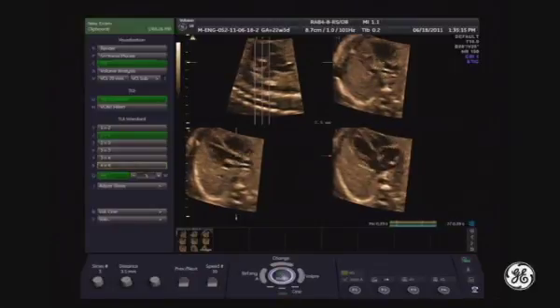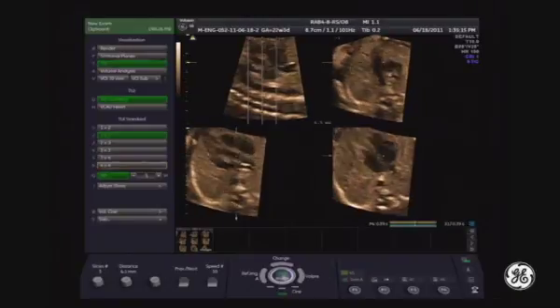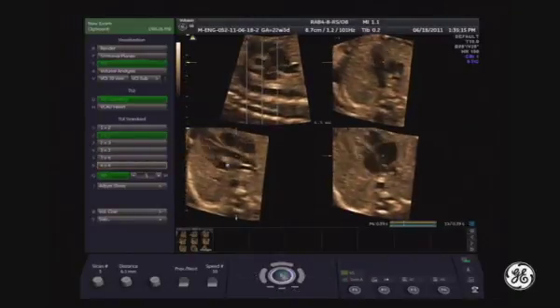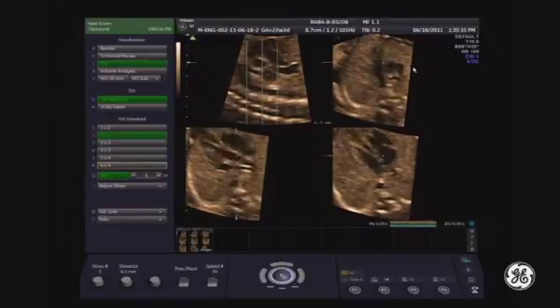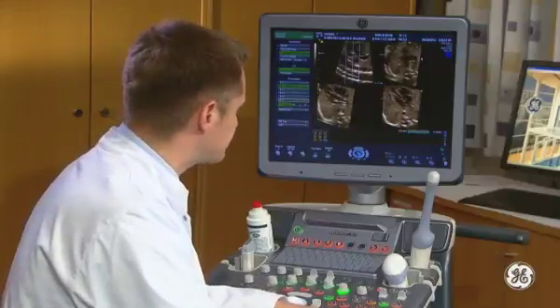And then I will increase the distance between the slices. Now you can see in one screen 3 major views. The aortic root is displayed here. Here you have the 4-chamber, and this is the right outflow with a classical 3-vessel view. So this is the other way of presenting the axial cardiac views.